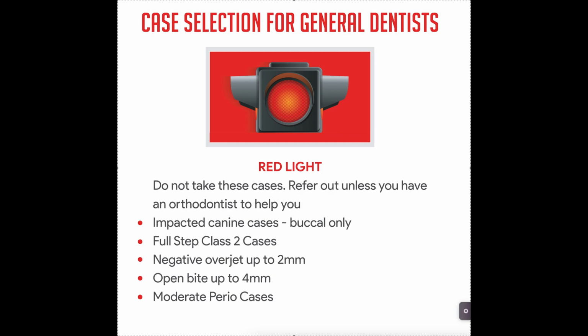Now we're going to talk about red light cases. These are ones that I don't want you doing. Refer them out, refer them out, refer them out. Unless you've done a couple hundred yellow light cases with an orthodontist and you have an orthodontist to help you with the red light cases. If you're relatively new at ortho, I do not want you taking these cases. Nope, you're going to hate it. You're going to struggle. Weird things are going to happen. These are hard even for orthodontists, and I can't always predict what's going to happen. So these are some guidelines to not take these cases.